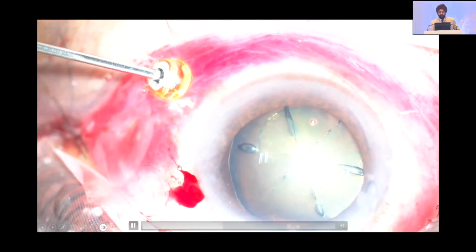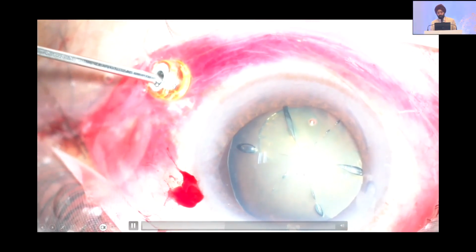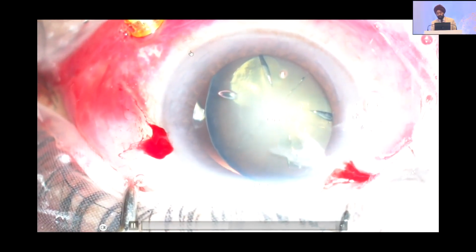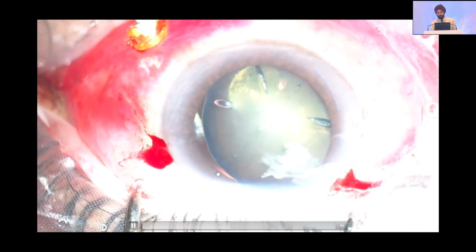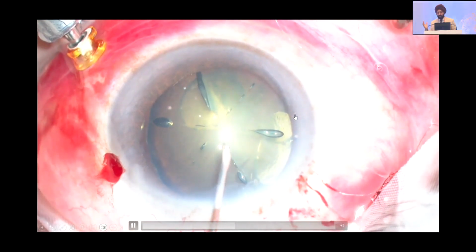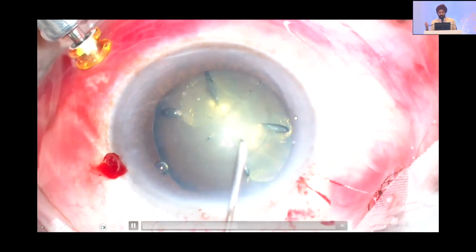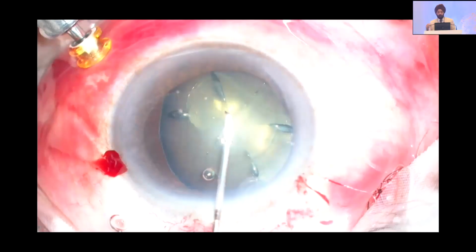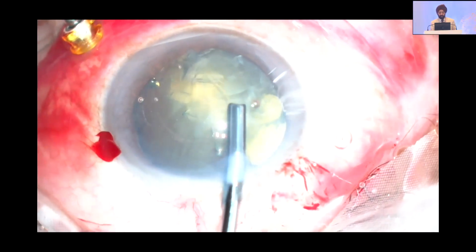Here again there is vitreous. We are taking away the fluid from the side. We have done the trocar cannula. You can see this is a vitrectomy. We have put the trocar. You see the lens moving towards that area. The capsulotomy again is free flowing. That again, to re-emphasize, Femto gives you a free floating capsulotomy or a good capsulotomy, irrespective of the amount of subluxation that is there.